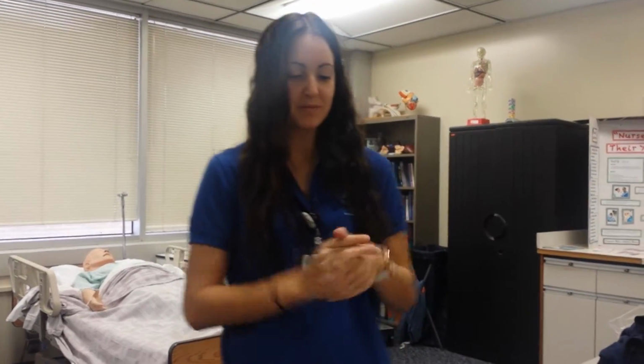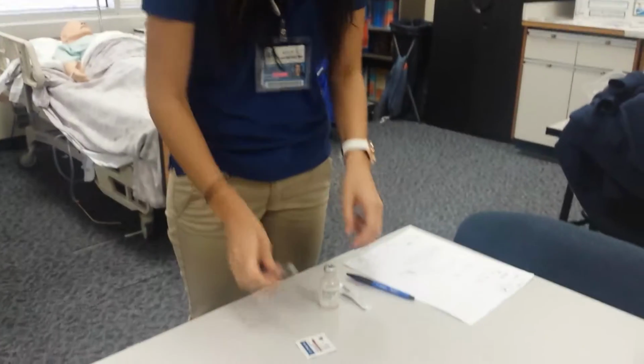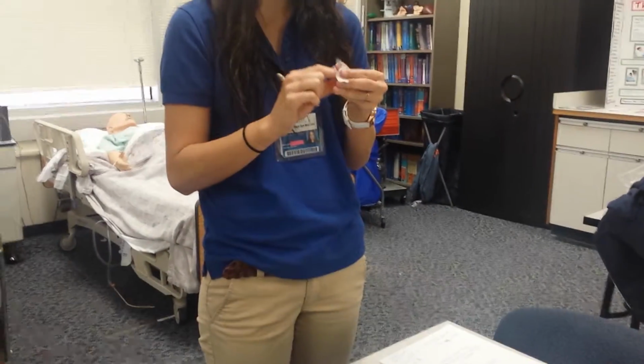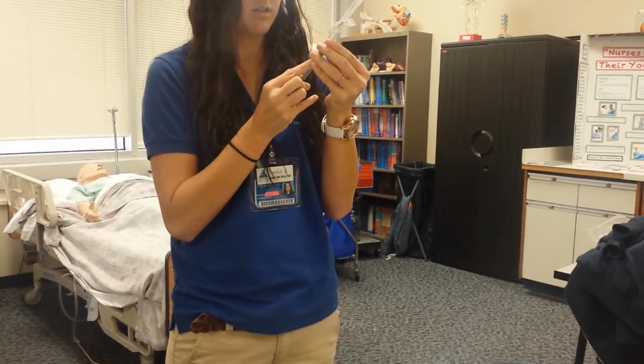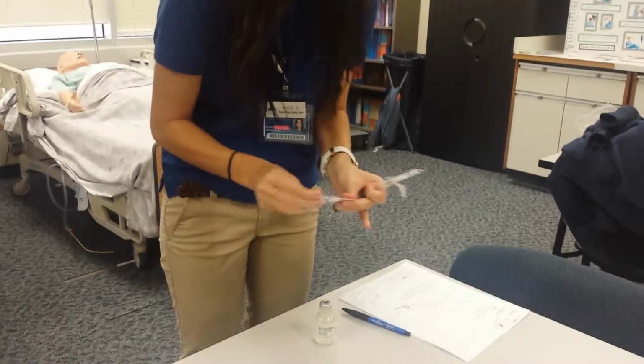So I'm going to wash my hands and draw up my 2.5 cc's or milliliters of vancomycin. Cleanse the top of my vial.